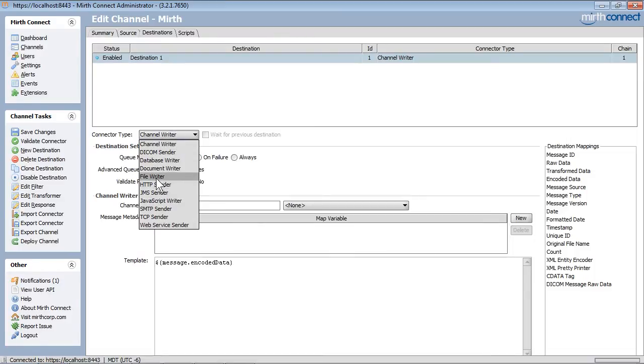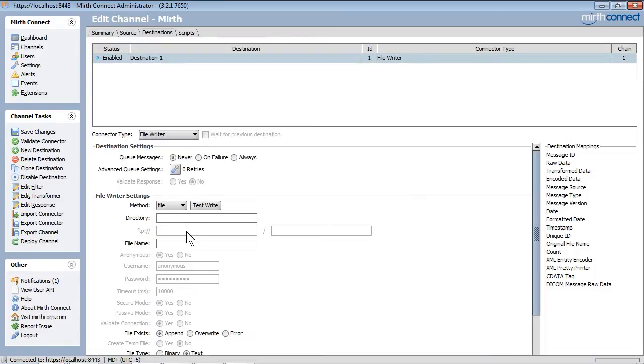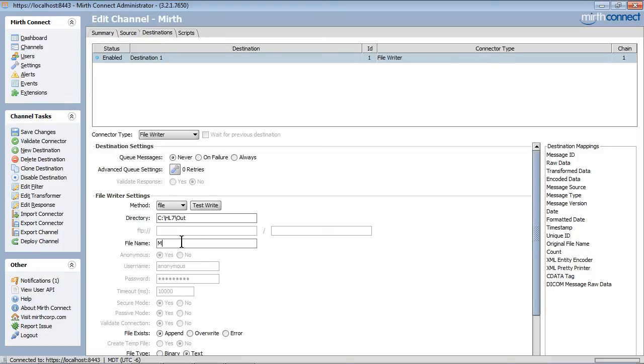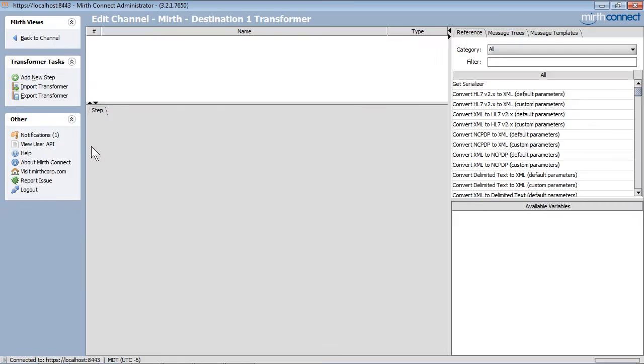In the outbound, we will specify a directory to put the output file to and a filename. We will now do the transformations.